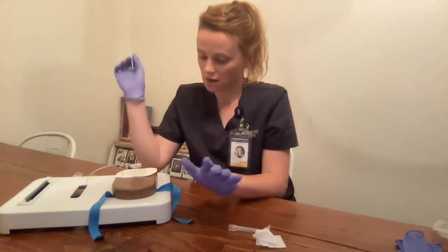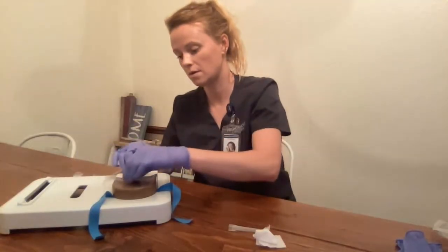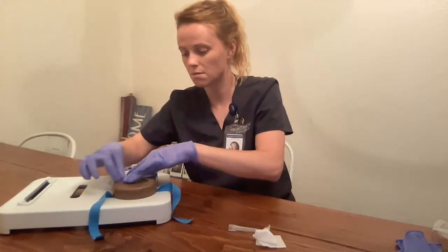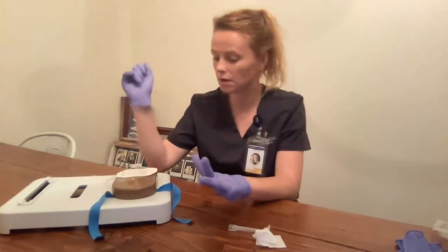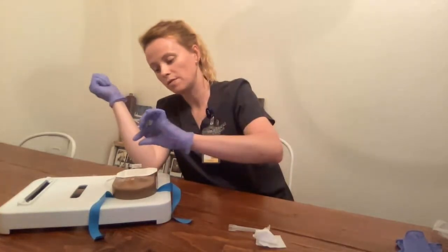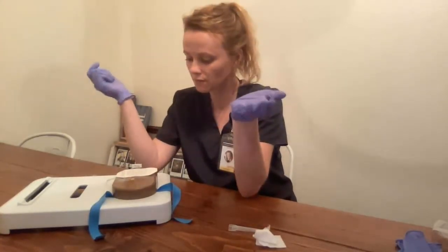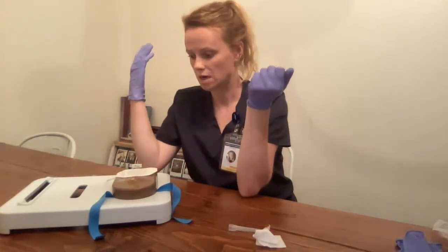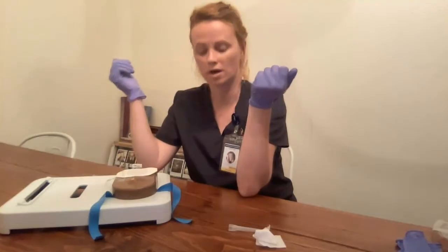It is on the IV here. I will then come on the side here and tape the end part of the extension tubing to my patient's arm. I will remove the white backing, or the outer part, on the sterile dressing. And then I will remove the sticky part that has my initials, and I will label everything I need to. It will say my initials, ES, the date, time, and the size needle — 22-gauge, 1-inch needle.